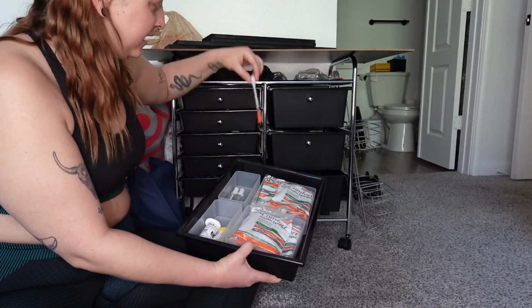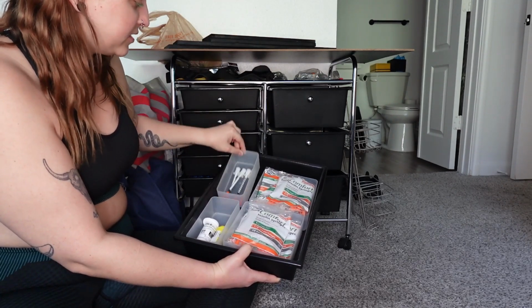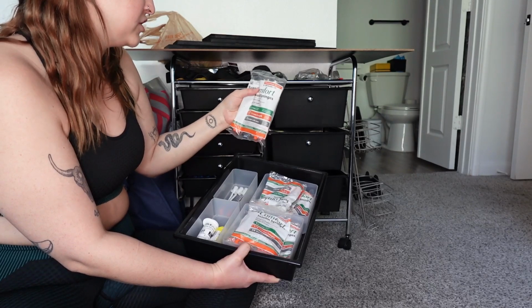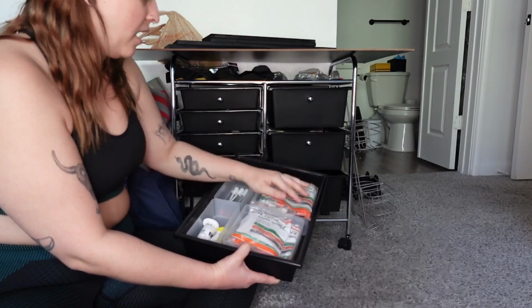And then any opened syringes go in here. So I'll open a pack at a time. I like to keep them in the packs usually just because I feel like it's a lot easier.